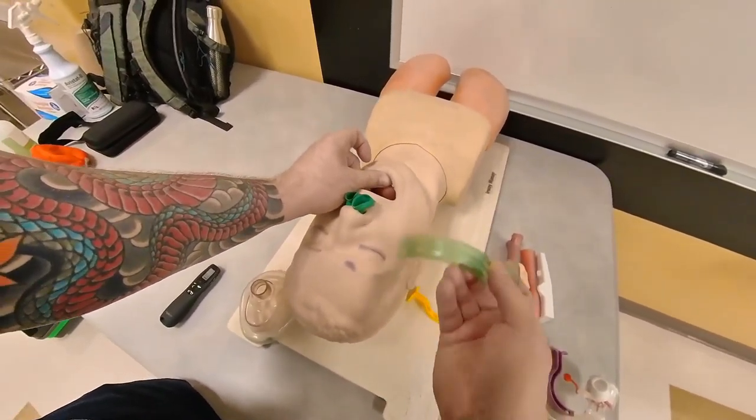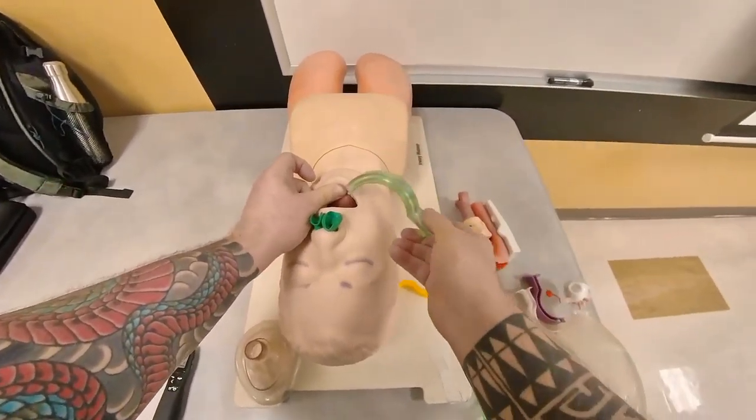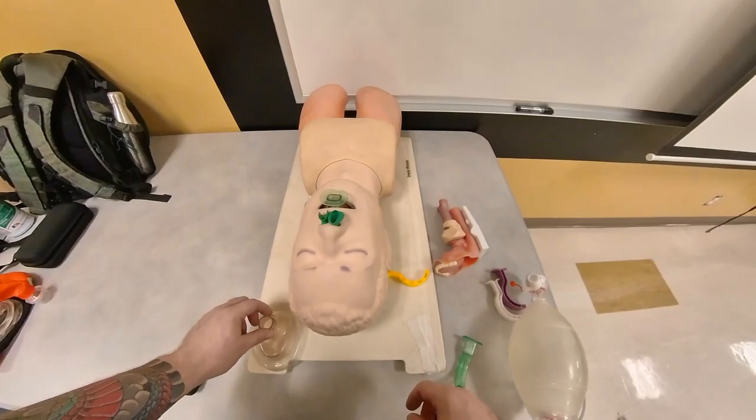For insertion, use the cross-finger technique to open the mouth. You can go from the roof of the mouth and rotate it 180 degrees, or you can go 90 degrees and rotate it. A patient who is unconscious will not have an intact gag reflex — they'll accept the OPA.